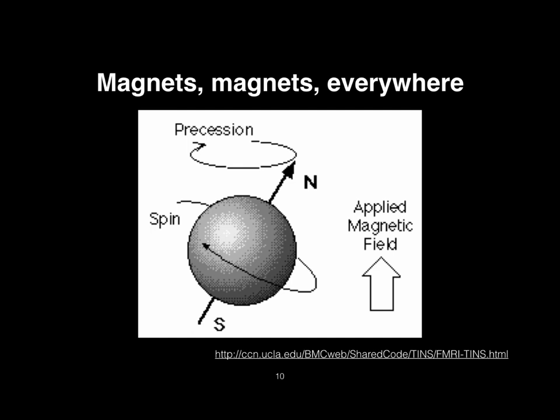Okay. And just for convention, keep in mind that when we talk about how these magnets are aligned, this is along the z direction. So if you're thinking in 3D space of x, y, and z, you normally align the magnetic field along z.